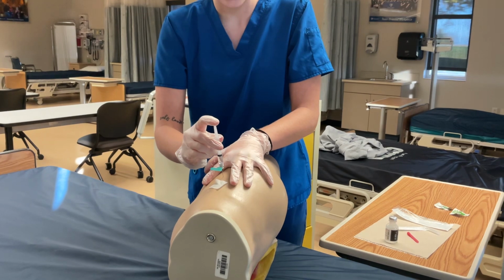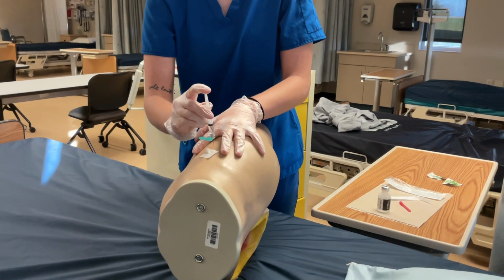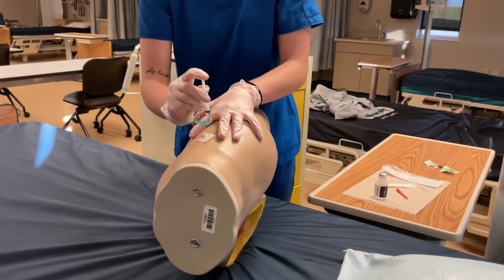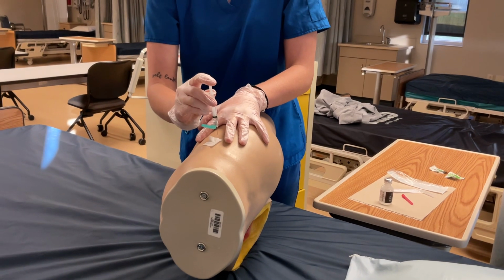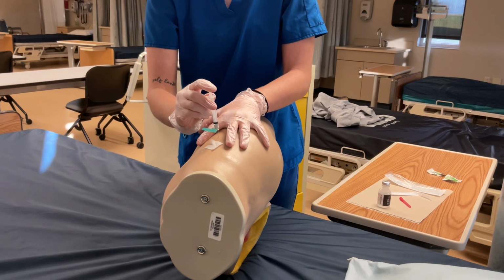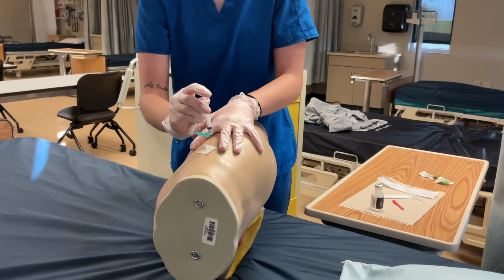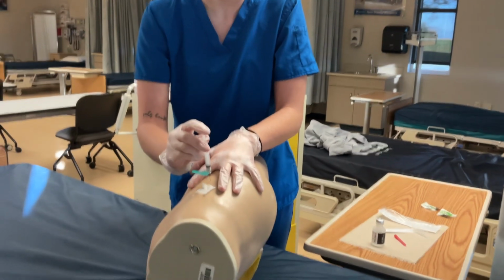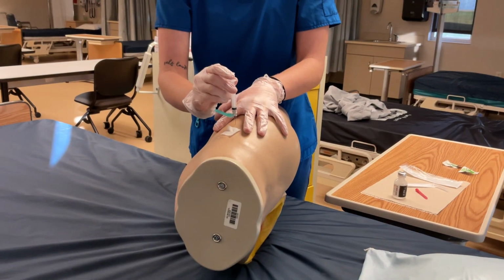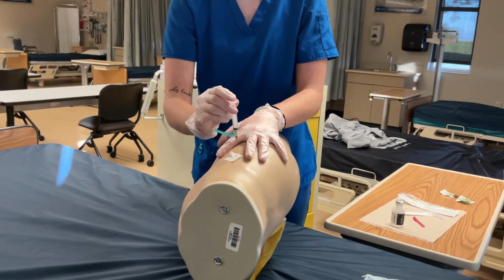I will inject the medication slowly, about 10 seconds per milliliter. So I will inject it for about 10 seconds as I'm only giving 1 milliliter. Do it nice and slowly. And then I'll leave it in there for 10 more seconds after I'm done administering it all. Then I'll take it out nice and slowly.